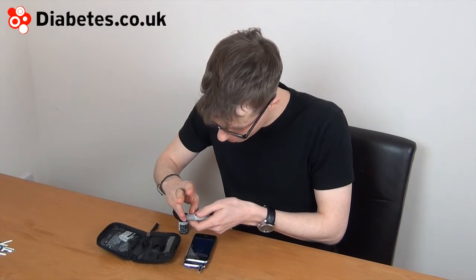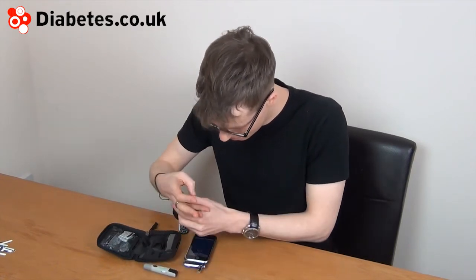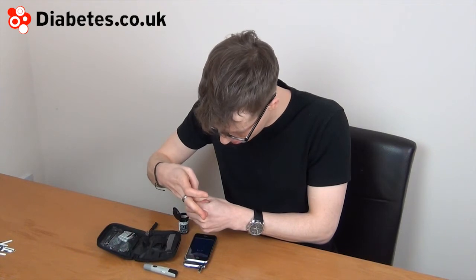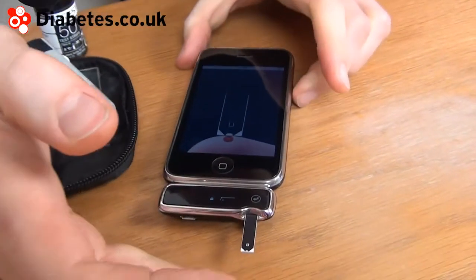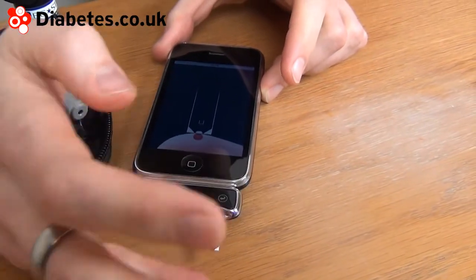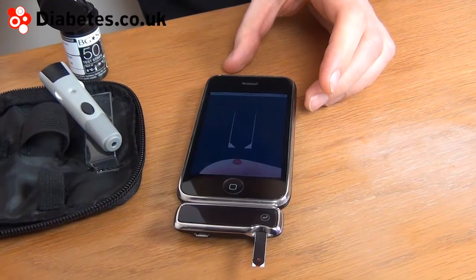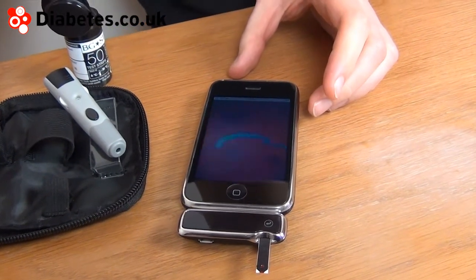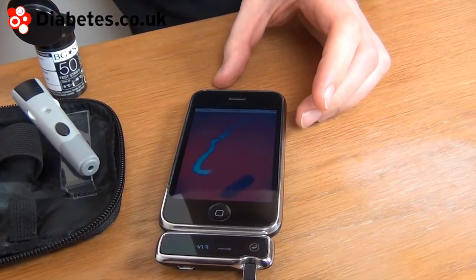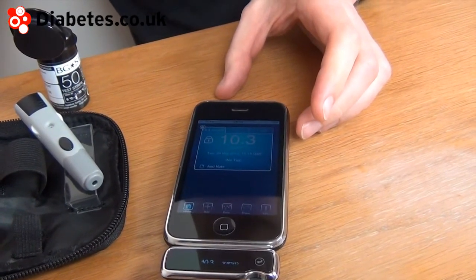I'll just take a sample of blood. That should be enough for the strip. We wait a few seconds and the meter will produce the reading. And we get a 10.3, it says.